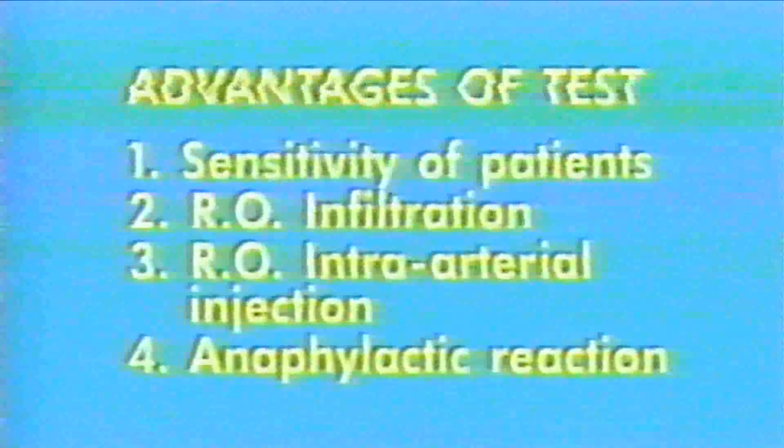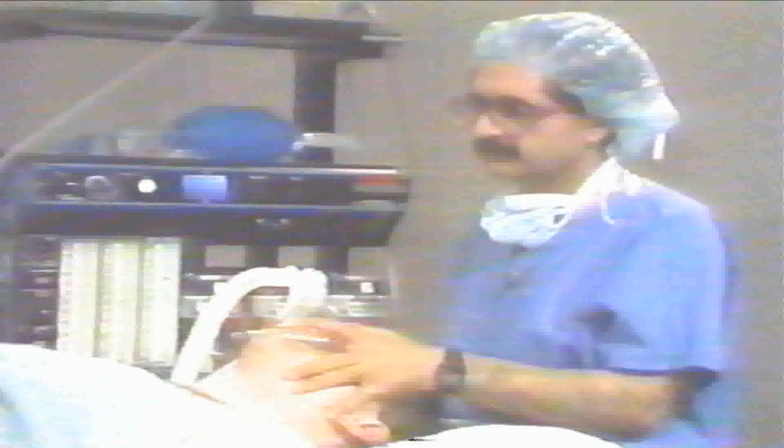Anaphylactic shock cannot be forgotten. One minute after the test dose, blood pressure must be checked to make sure that the patient has not changed his blood pressure much. And then respiratory depression is evaluated by asking the patient to take a deep breath. Please take a deep breath, sir. In and out. Okay, the patient responds, so that means he's still light. If the patient does not respond, he may not need a large dose to put him asleep.